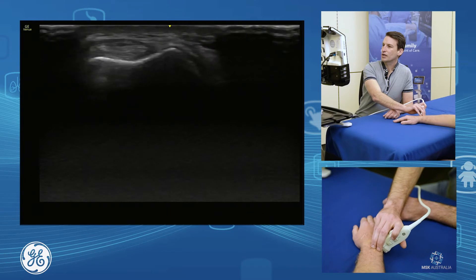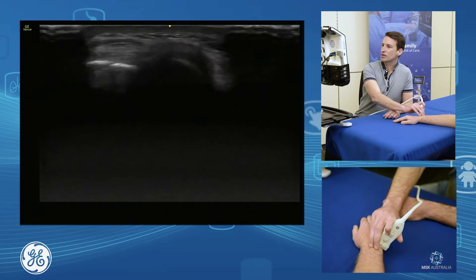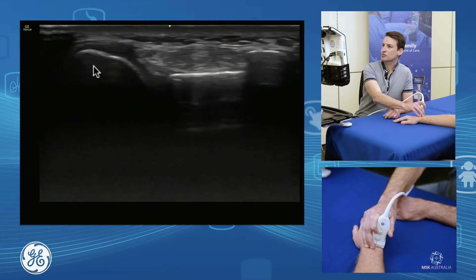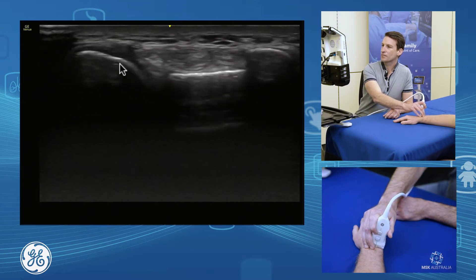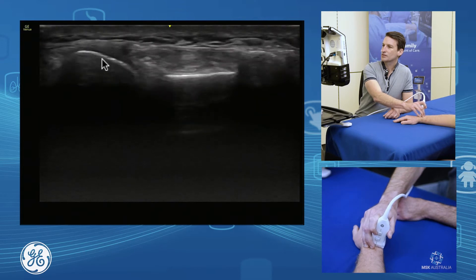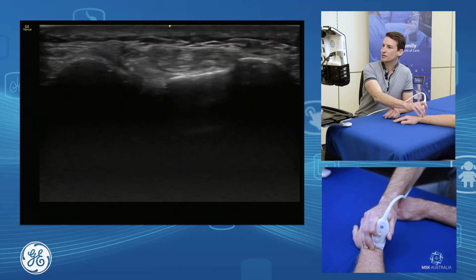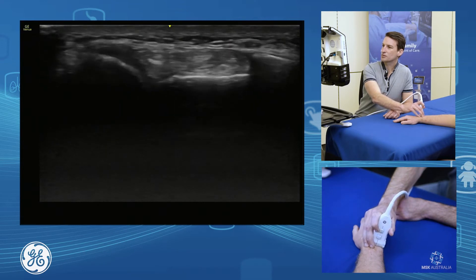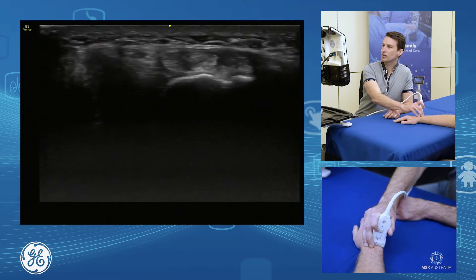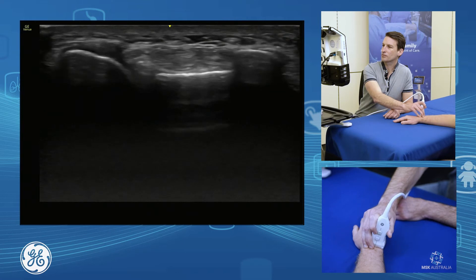Right next to that is our distal radioulnar joint. That's our distal radioulnar joint, and as we just fall off the ulna, we're off it.